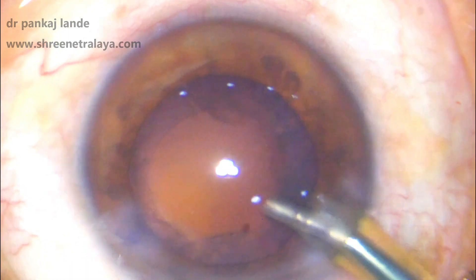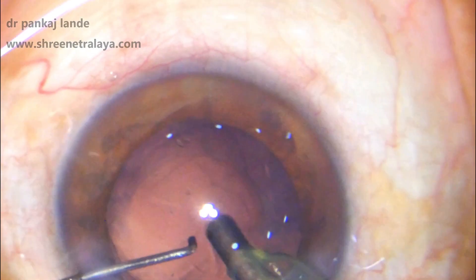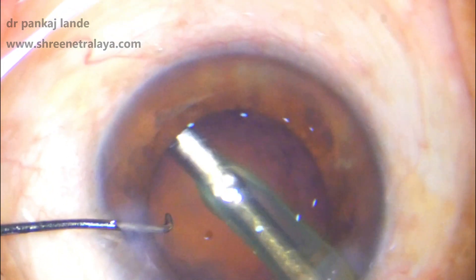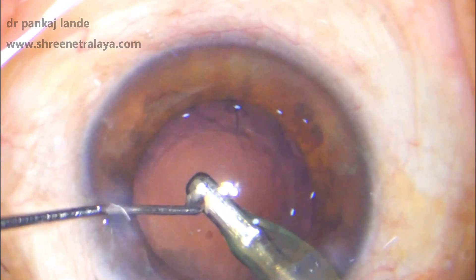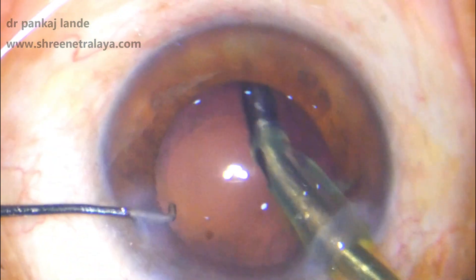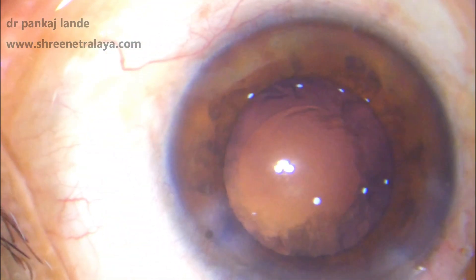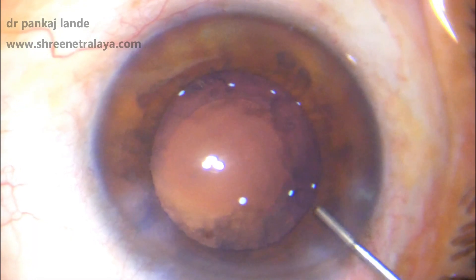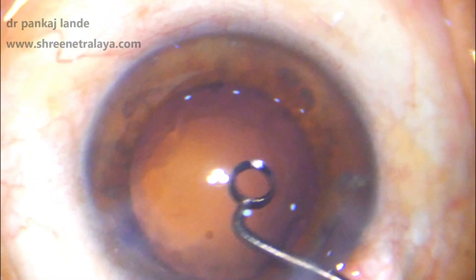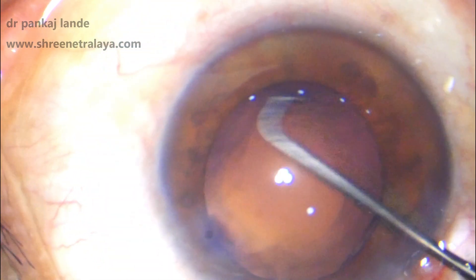This is followed by irrigation and aspiration. A coaxial probe with a bent tip is what I use usually. Depending on your preference, you can go for bimanual IA tips also. A sweeping movement from side to side is important while removing the cortex. I have a little bit of cortex in the periphery which I have not touched with my IA probe — I am now doing anterior capsule polishing.